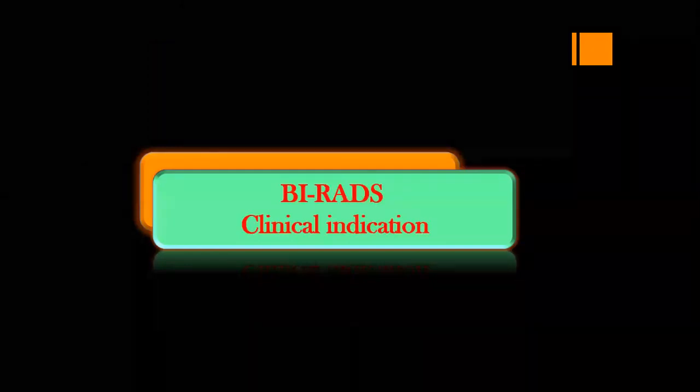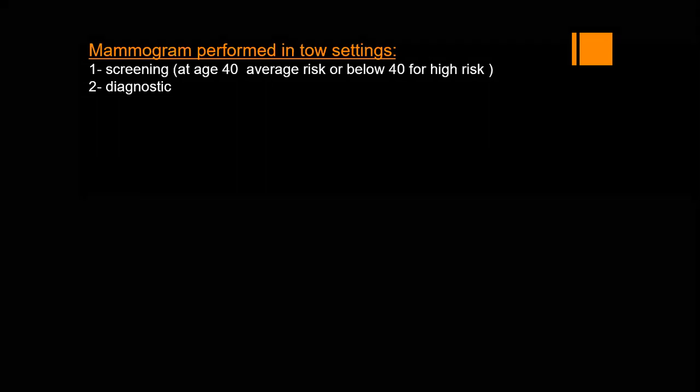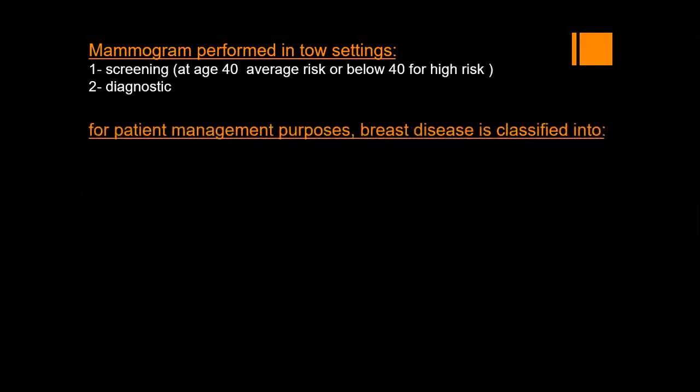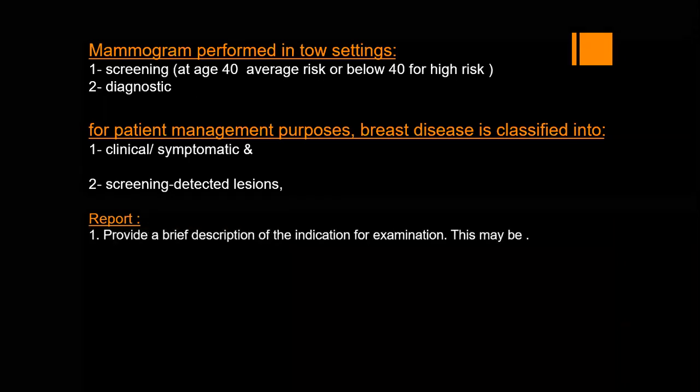So starting with the clinical indications. Mammography is performed in two settings, as you know, either screening for high-risk women or for average-risk women after the age of 40, or in a diagnostic setting. For patient management purposes, breast disease is classified into clinical or symptomatic cases versus screening-detected lesion cases. So our report should start with the clinical information or the indication for the study, providing a brief description of that indication, which may be screening for asymptomatic women or diagnostic mammography for certain indications.